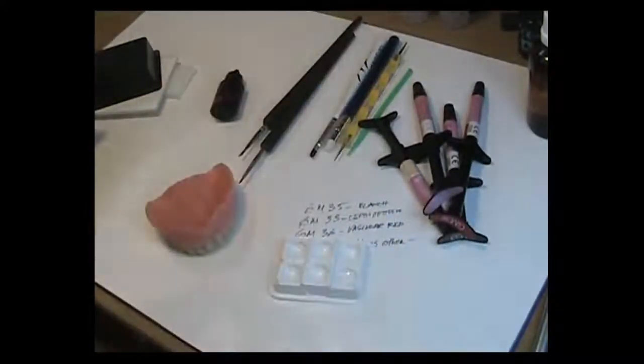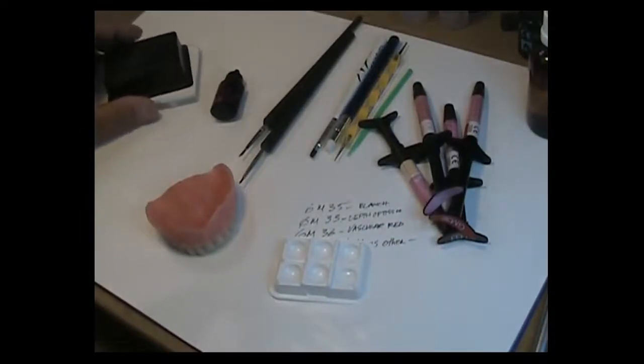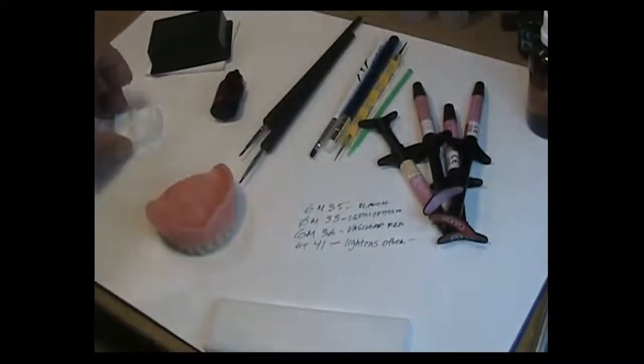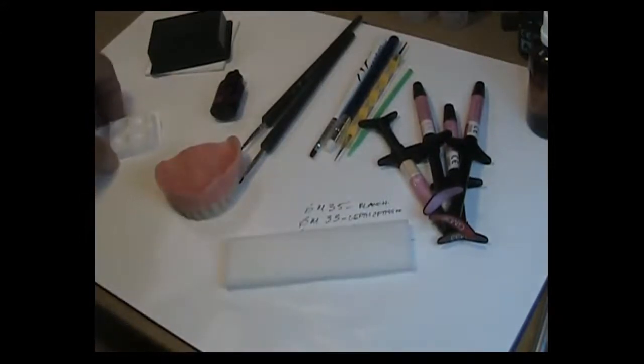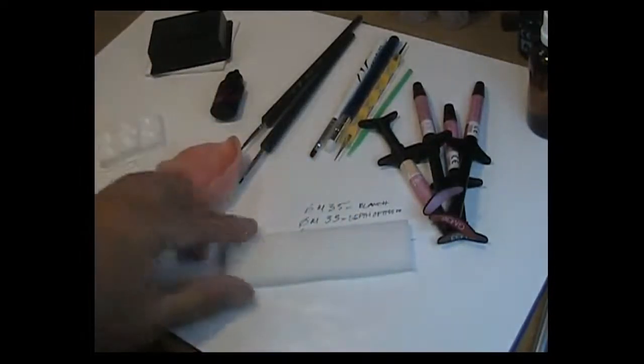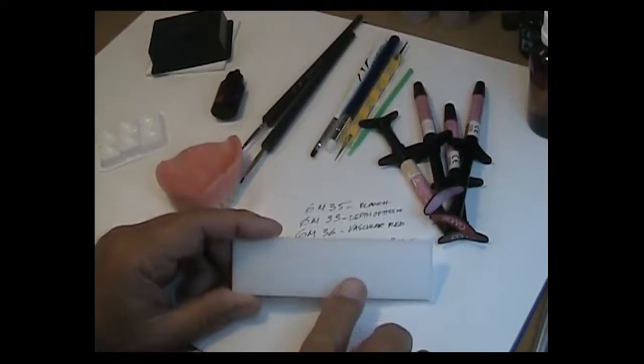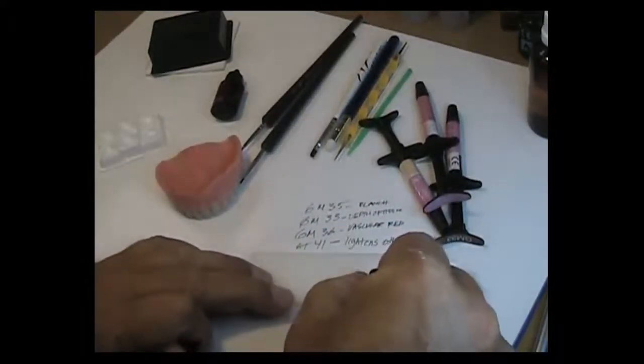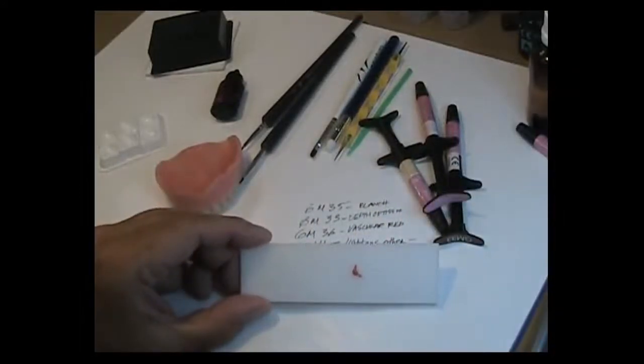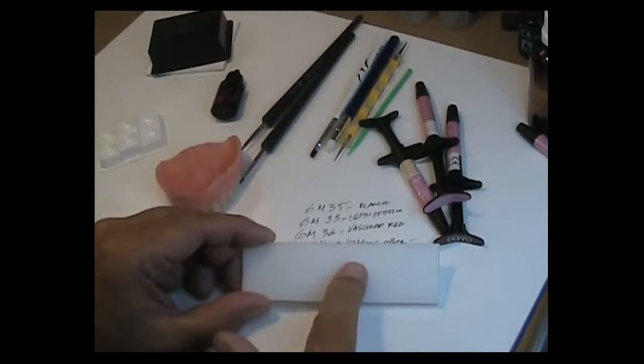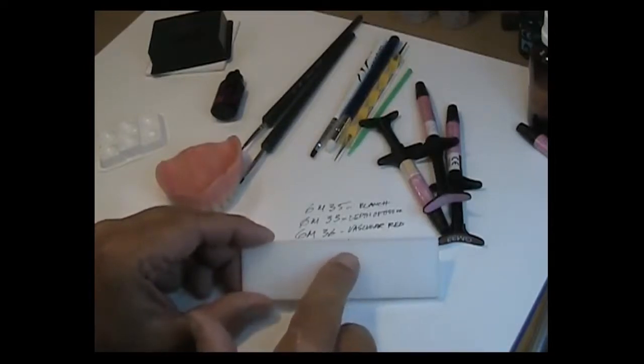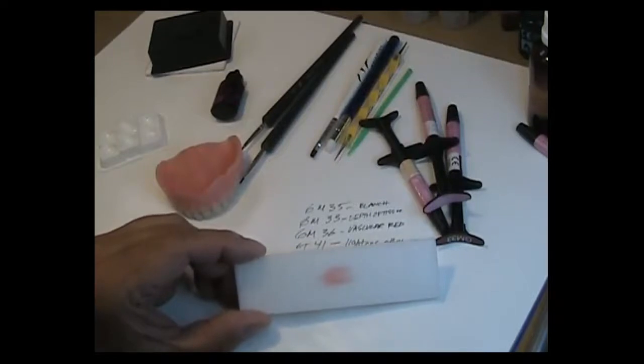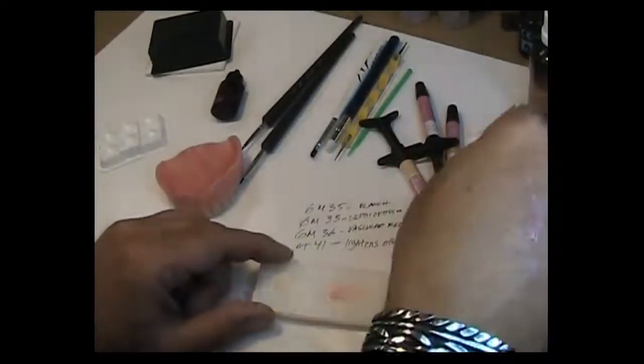I've got the well. When I'm using the products I have to have something to be able to see what color I have. Like I said earlier, this comes in the kit but I found that works even better is a white piece of phenolic or marble, any type of a white background so that when I lay the colors on this area I can judge intensity based on the background. And see, like if I smear it like that I can see and understand immediately the intensity that each color that I'm going to apply brings to the acrylic. It's easy to clean after I get through. As you're using these products, by the way, always remember that when you take some product and put it out for yourself and then you use it.